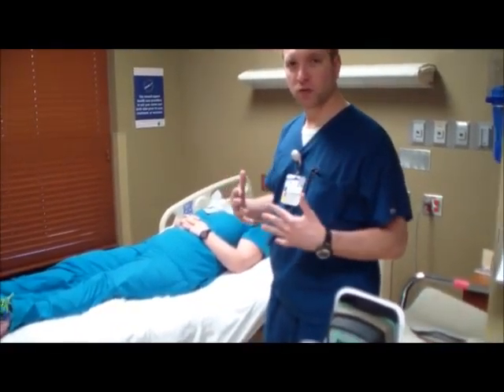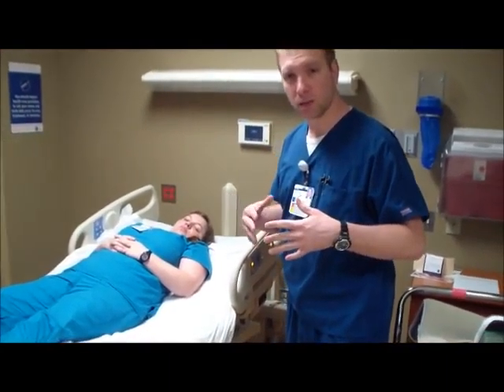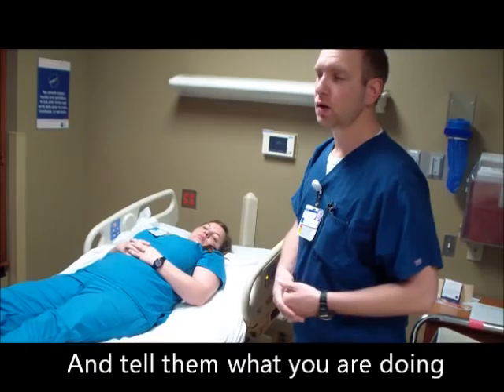So I'm going to come in and introduce myself. Chelsea, my name is Dave. I'm one of the physical therapists here. You're going to introduce yourself as, hello, my name is Chelsea. I'm one of the physical therapy techs here. I'm here to apply CPM onto whatever knee.